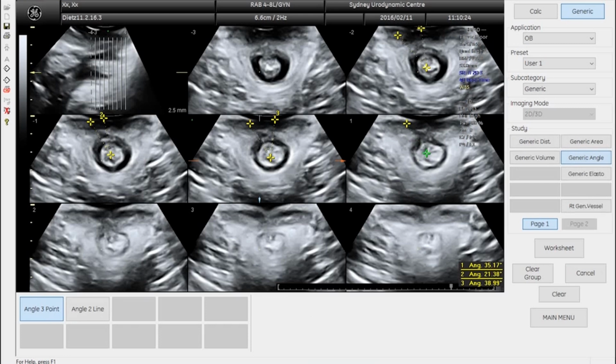You can see that such a short time after a sphincter repair, in particular if there is still suture material around, it's often harder to know exactly where to put your defect angle. One envisages that these appearances will be a little easier to interpret in another 3 or maybe even 6 months, given that this was a delayed absorbable material.